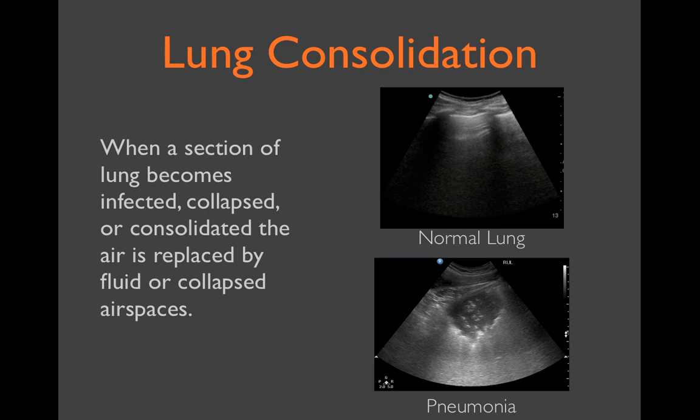However, when air is removed from a section of lung and the air spaces are either collapsed or filled with fluid, the deaerated lung parenchyma produces a tissue image that is easily identifiable with ultrasound. Here we see normal lung tissue in the top picture, but in the bottom image we see a focal area of consolidation with normal aerated lungs surrounding it. This represents a small right upper lobe pneumonia.